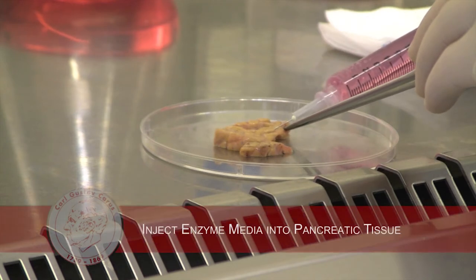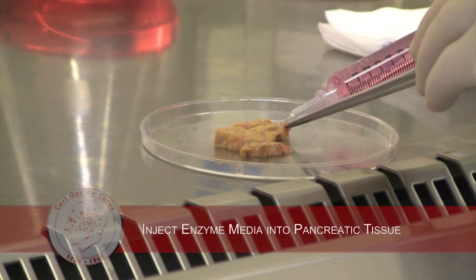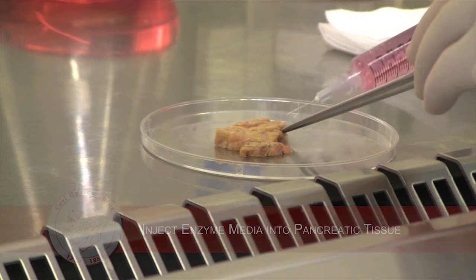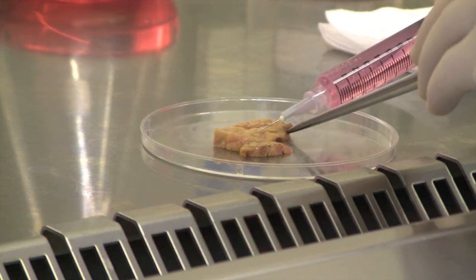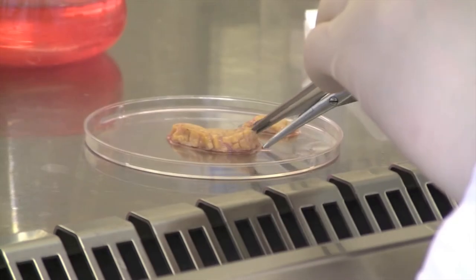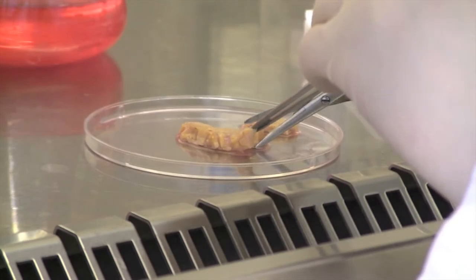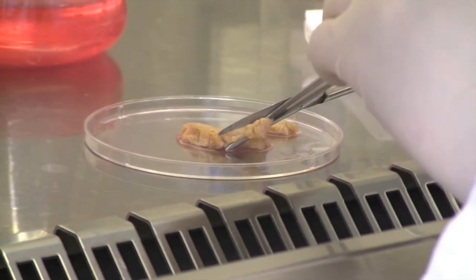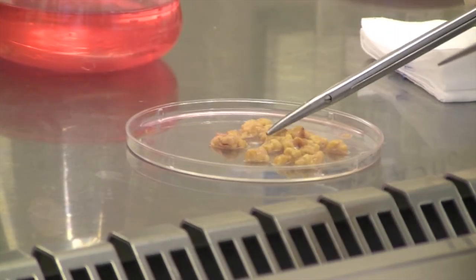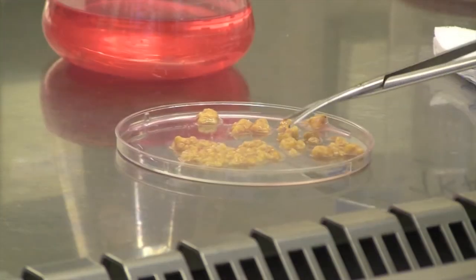The cleaned pancreatic tissue is then distended by the injection of the enzyme-containing media and minced into small pieces to increase the surface area and facilitate the process of digestion. This mincing step is crucial because the distension by injection alone does not allow a proper distribution of the enzyme within the tissue.